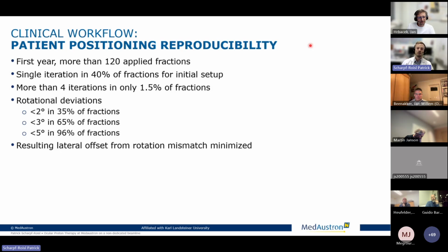the first iteration. So it's a bit of a learning curve for us as well, because we thought first we're going to use this fixed lookup table decision tree, but the decision tree then showed its limitations based on patient performance.